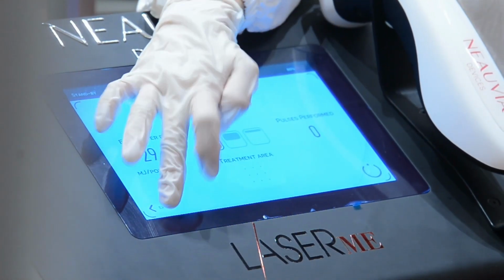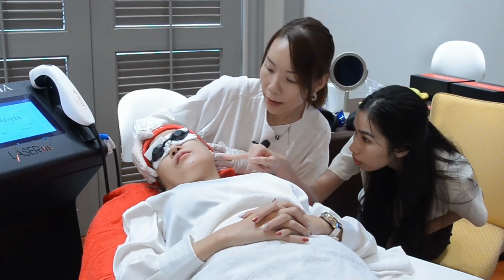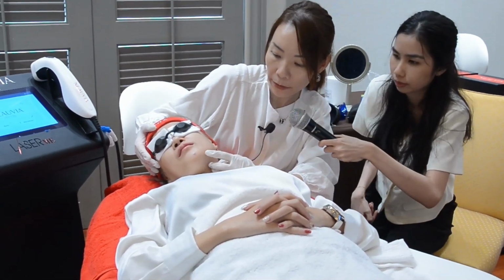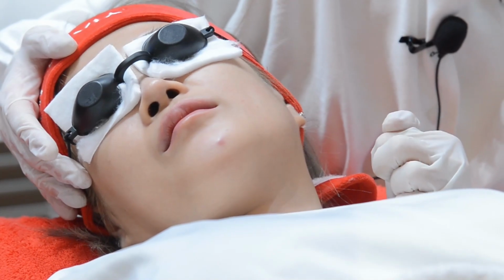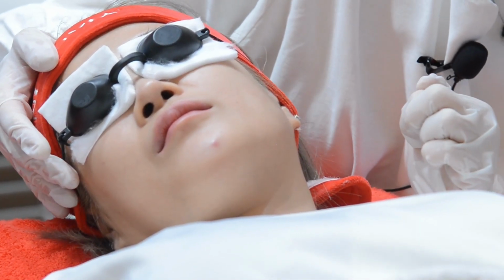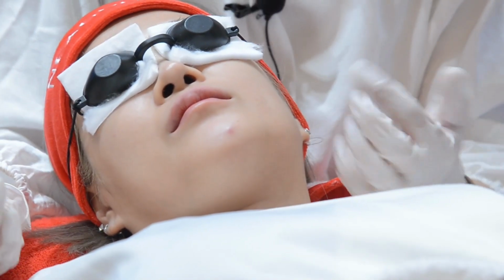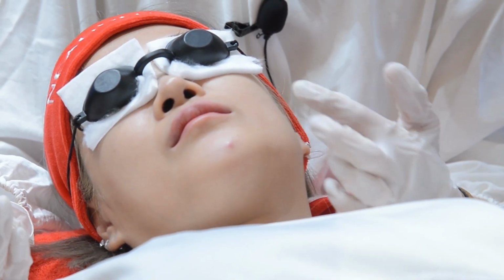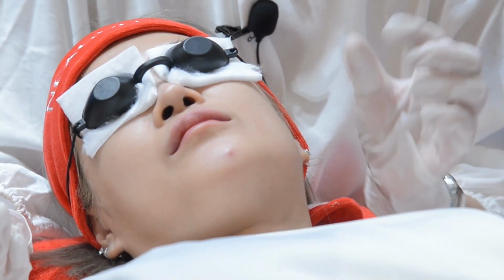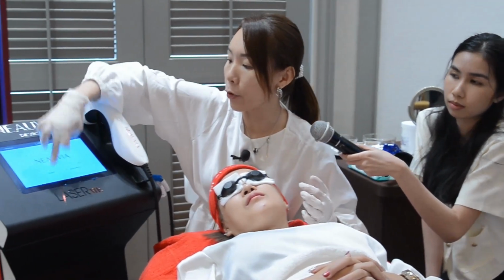Okay, so let's take a look. You can start to see a little redness. The shots that I did, can you see the dots? A little bit, right? So sometimes after a treatment, you will notice that maybe after 5 minutes when the dots are more obvious, you'll be able to see little gaps where if let's say the previous shot you have not done very close enough, you can actually top it up, touch up, and then you can still go back to choose.